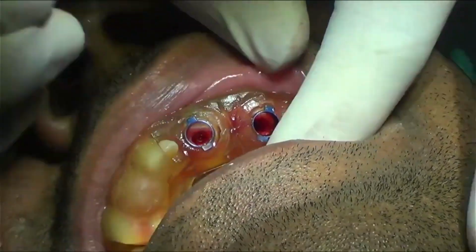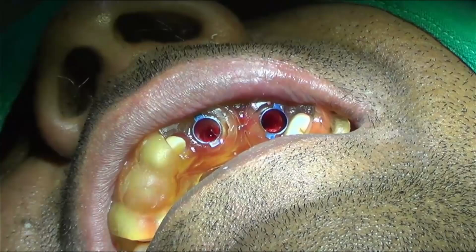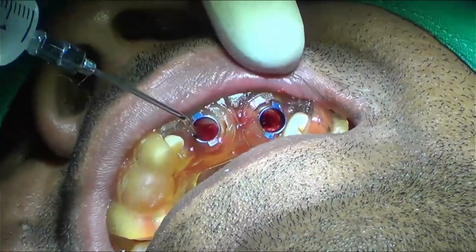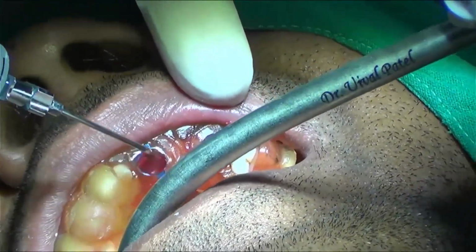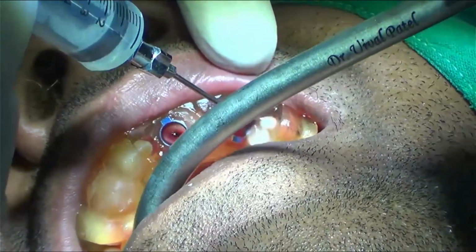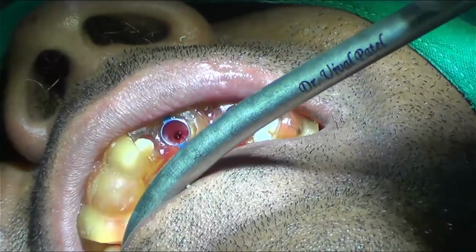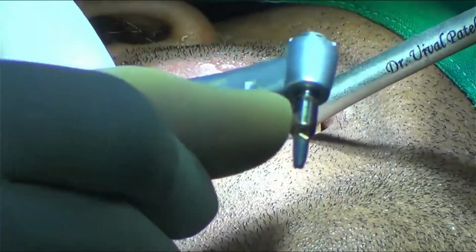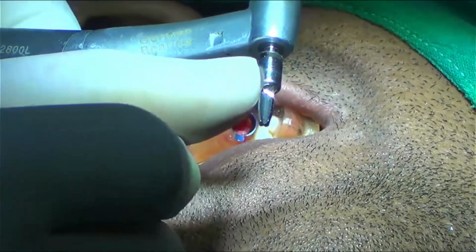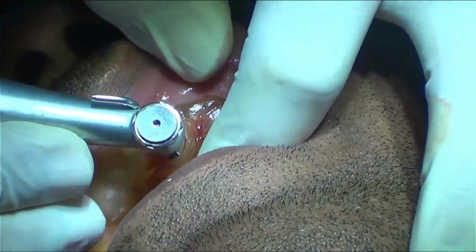Equally, sir. Equally. Thank you. So the next drill is basically called your profile drill. It is not having a stopper. So again, for 9 mm offset, we have to go till the bottom of the first black mark. Okay, till the bottom of the first black mark.